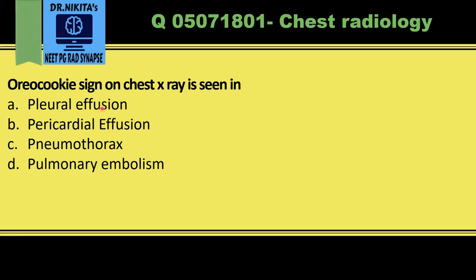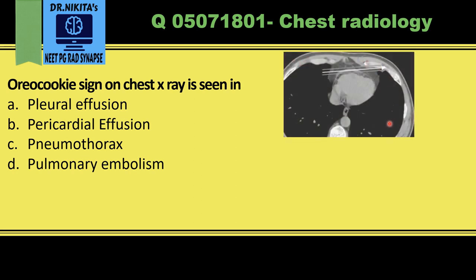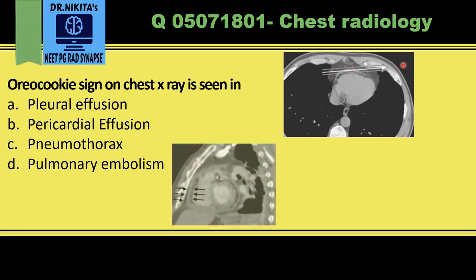The Oreo cookie sign on chest x-ray is seen in pericardial effusion. On this CT scan of the chest, the heart is visible, with a strip of pericardial effusion between the epicardial and pericardial fat. On a sagittal image, we see the pericardial effusion between two black lines — fat appears black due to its negative HU value. The outer black line is pericardial fat and the inner black line surrounding the heart is epicardial fat, with a grey or white line of pericardial effusion between them, just like an Oreo cookie.